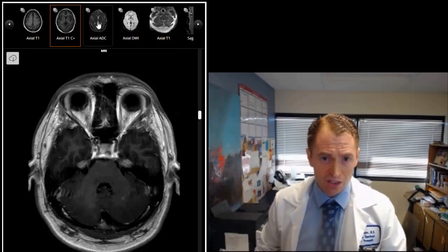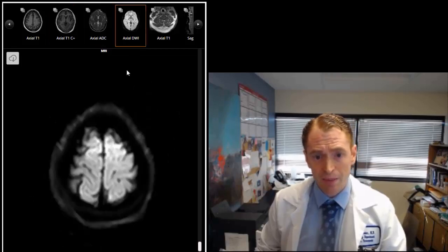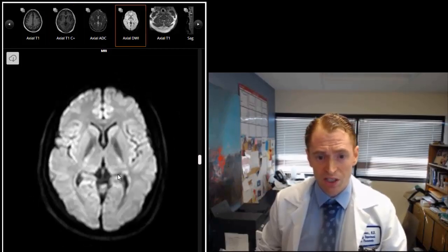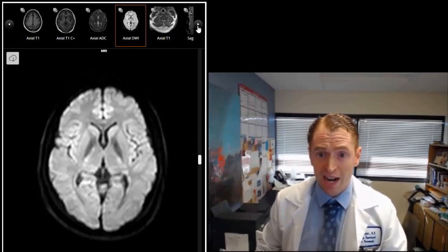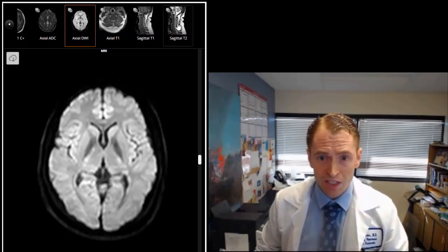Now I won't talk too much about these other sequences, but ADC and DWI are used mostly for diagnosing acute stroke. But a lot of MS lesions can be a little bit diffusion restricting if they're active. But now we'll move on to the spine.